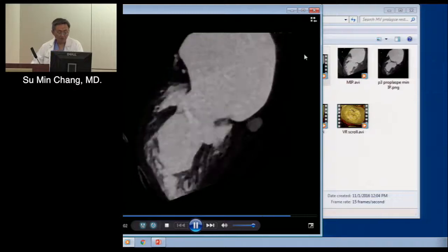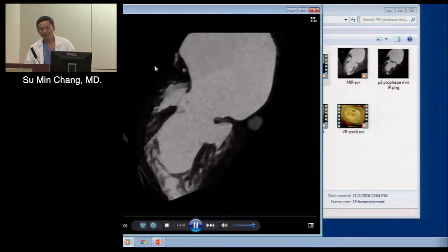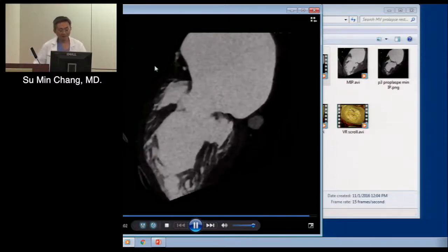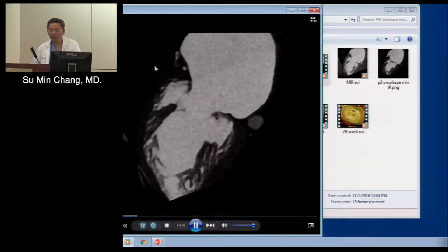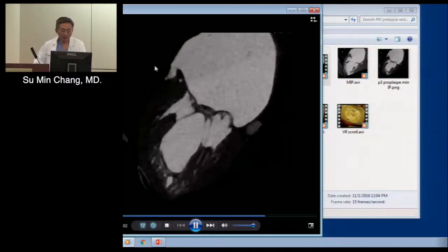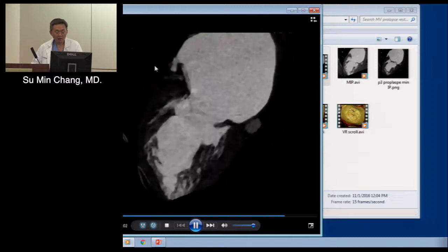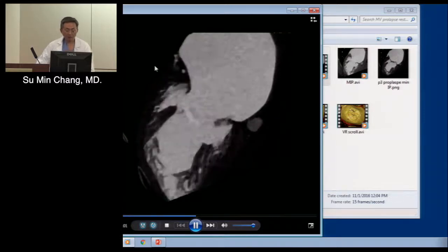If you look at this, Mohammed, do you think this is 2D or 3D? It's kind of blurry, right? The line is blurry, right? It looks like 2D, but you see some depth, right? So it's kind of like what we do with 3D echo, but zoomed in. You're getting a slice of the heart. Technically it's 3D, right? But for practical purposes, let's say you cannot see through the depth and you think this is just 2D. So this is 2D in motion, different parts of the cardiac cycle.